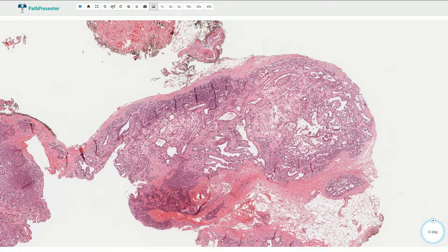Some of these lesions can be associated with underlying hemangiomas or vascular malformations. Technically, we have a benign vascular tumor which is complicated by thrombosis, and the organization and re-canalization of that thrombus can lead to the formation of papillary endothelial hyperplasia, or the Mason tumor, as we can see it here.